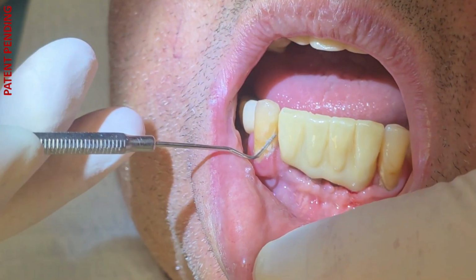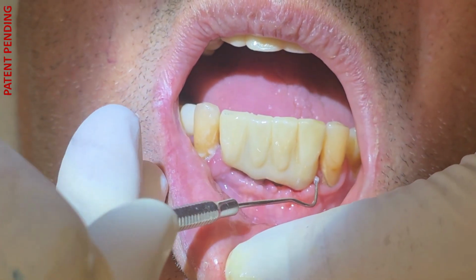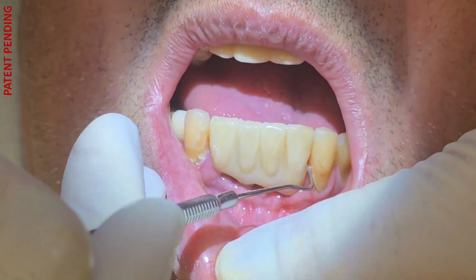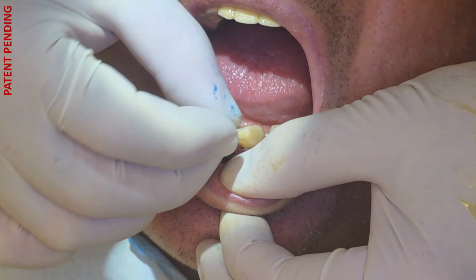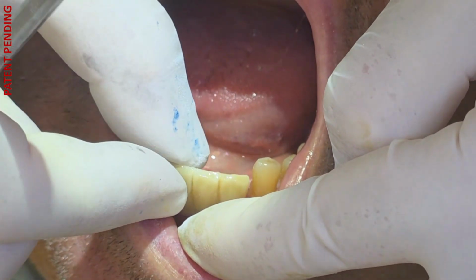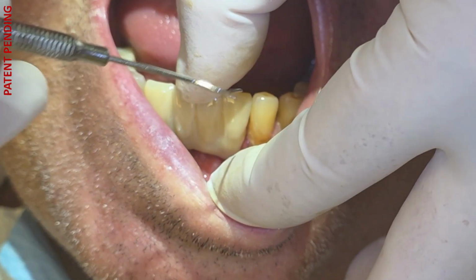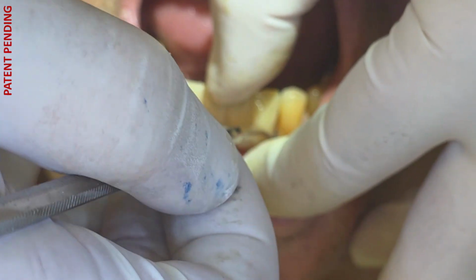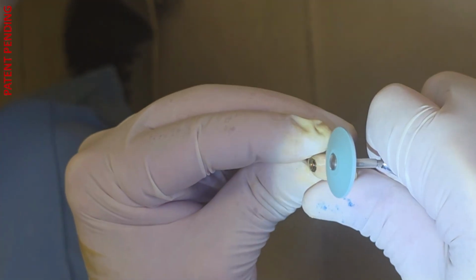We check the wash-through channels. For a patient with poor hygiene, this is especially important. In the region of teeth 32 and 33, there is inflammation and insufficient space for cleaning. The construction is removed for refinement. Excess material is removed, the bridge is tried in again, and the probe is used to check the hygiene space. The probe is still catching, adjustments continue.